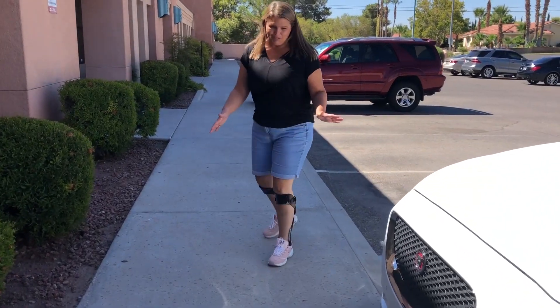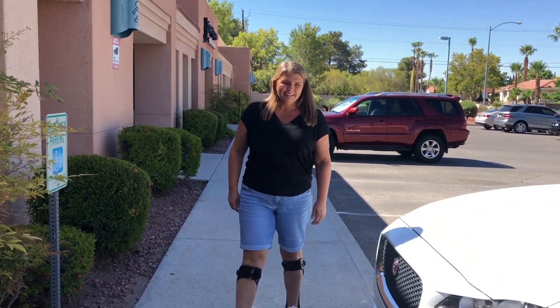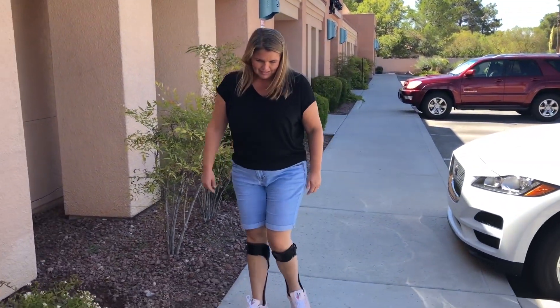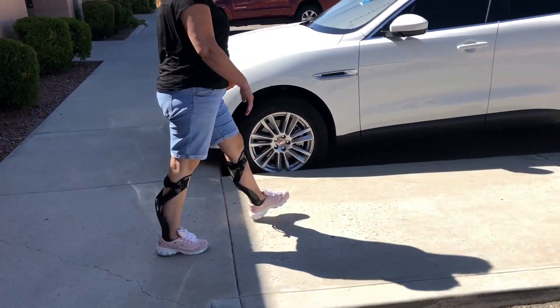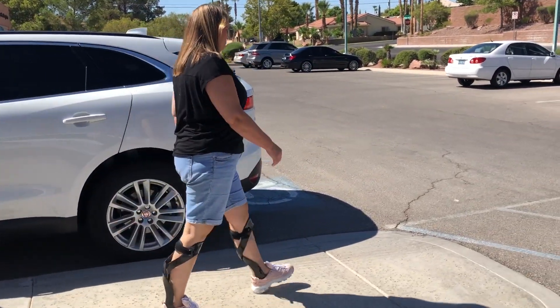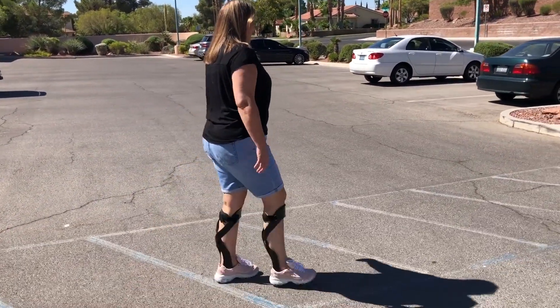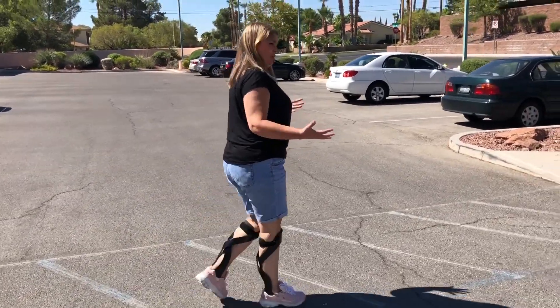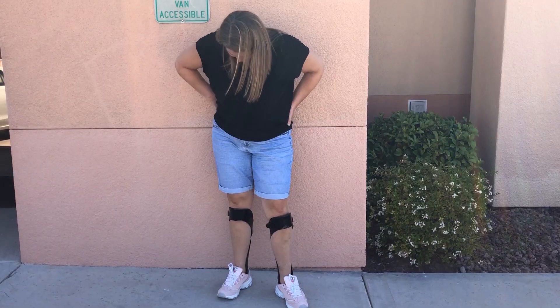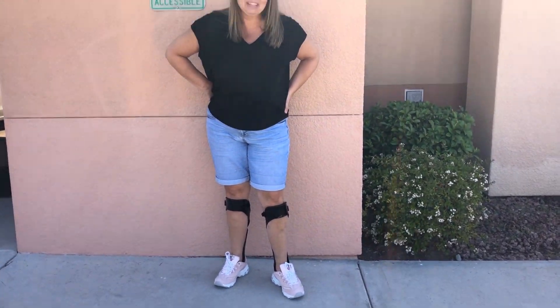People don't understand what it's like when you're dragging your feet and you have to constantly lift your knee to get your feet out of the way. How does it feel going down the ramp? It's stable — I just feel stable. I'm not off balance. It feels amazing. I love them, they're awesome. Thank you Mitch.